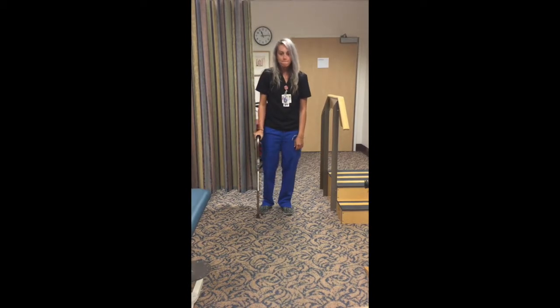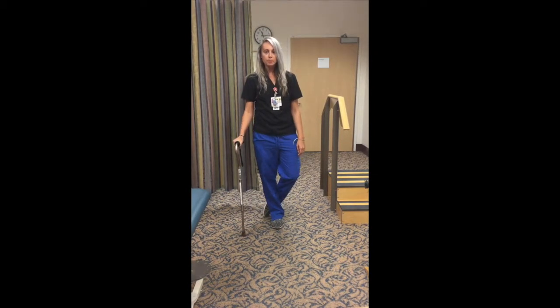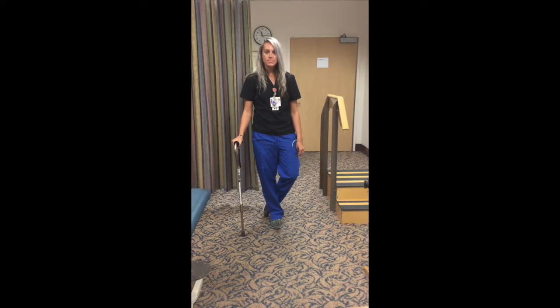That's a great visual explanation. Let's go back. It seems like there's two stages. Stage one, where you're going almost a 3-point gait, where it's cane, foot, operative leg, cane, foot.